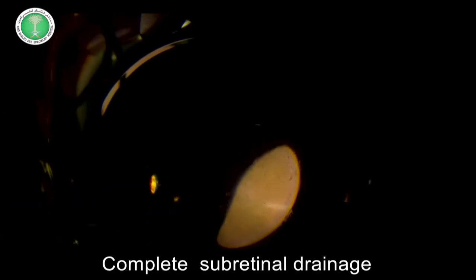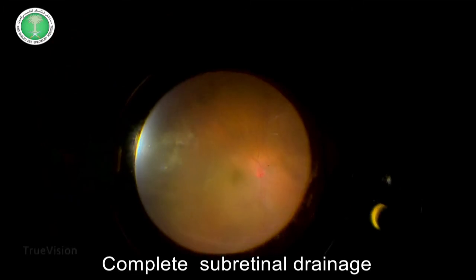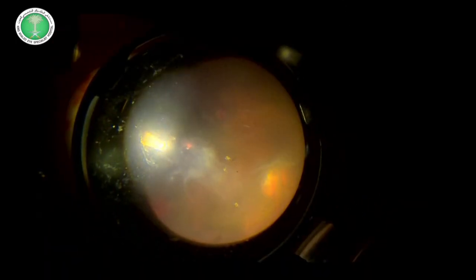This resulted in complete subretinal fluid drainage, which gives us the chance to place precise cryotherapy to the causative break.